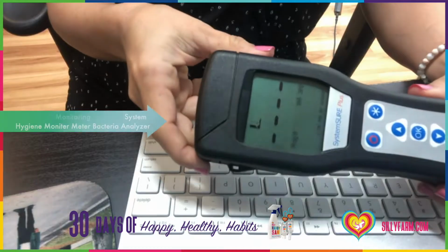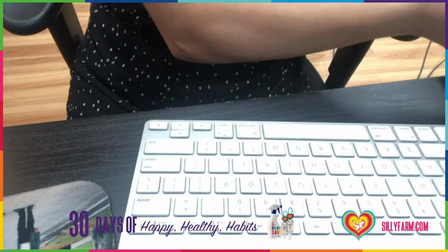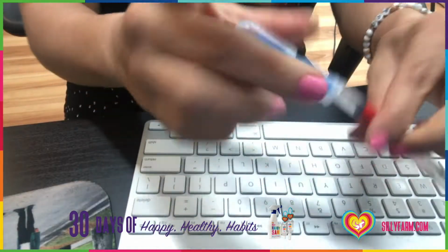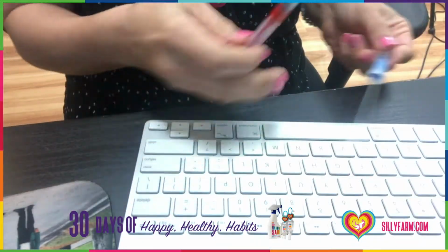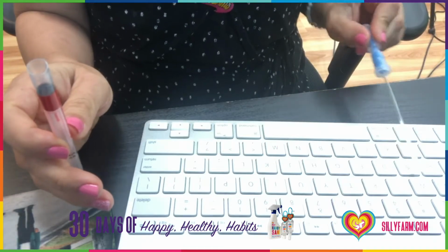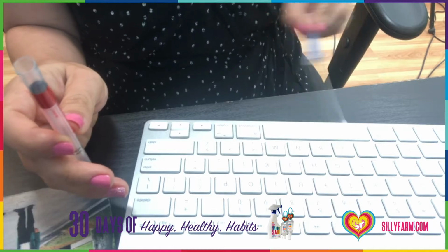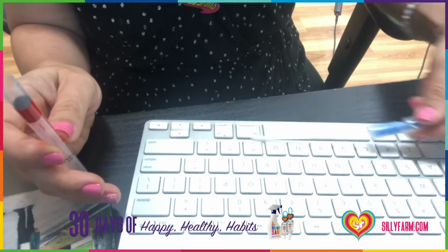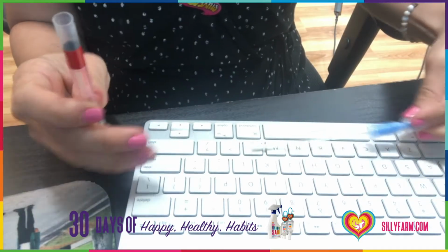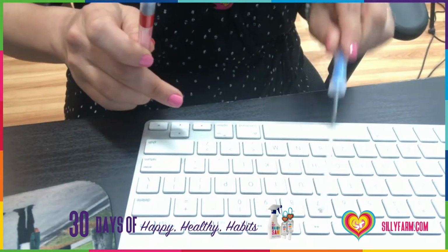Okay, so I got my tester and my ultra snap. So you just take it out, and I'm going to take samples of the keyboard because you use it every day, and you should clean your stuff every day. You can see where some of the ones are a little dirtier.